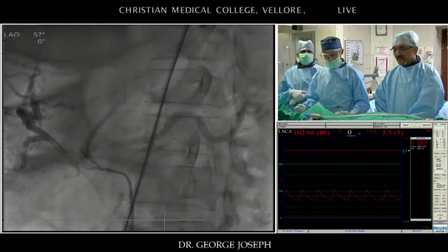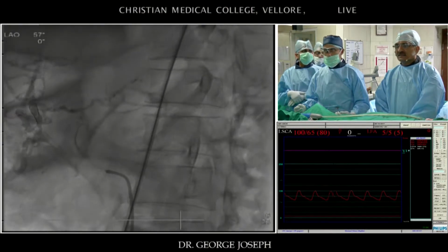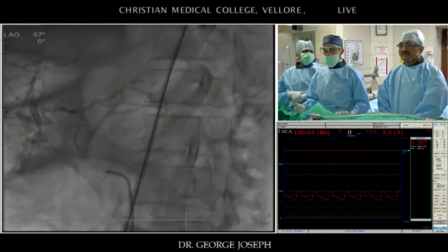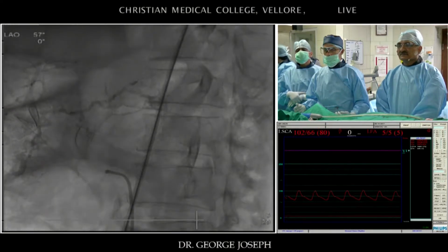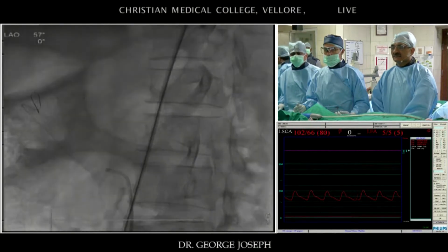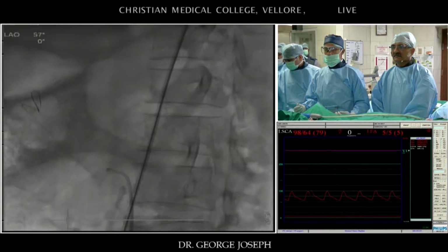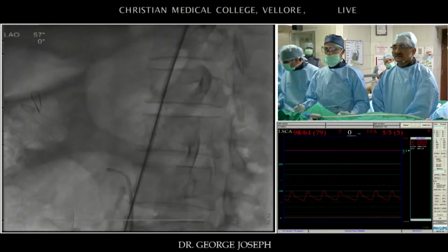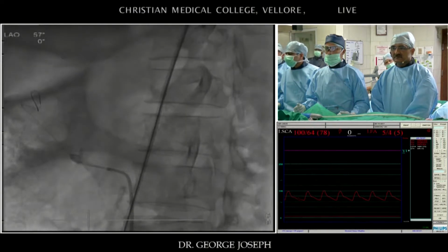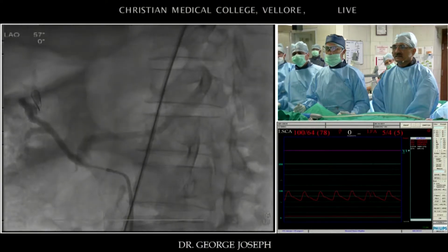Right, Dr. Joseph, this is a very clear explanation of what you're planning, and I think this is very important, and how to plan your case. I think it's very nice to show us all the steps that you have done, including CT and creating the fenestrations, and a wonderful job. Sushil, any comments? No, it's just your decision to go forward, even though it's asymptomatic, is based on the size of the thoracic aorta? That's right.